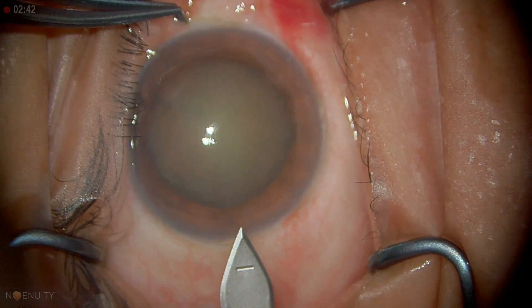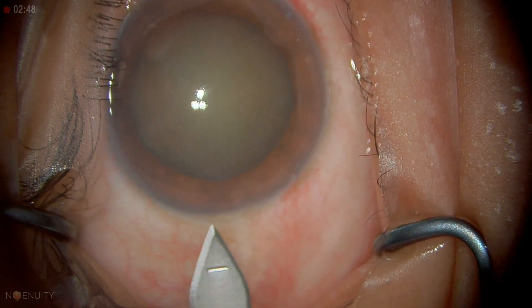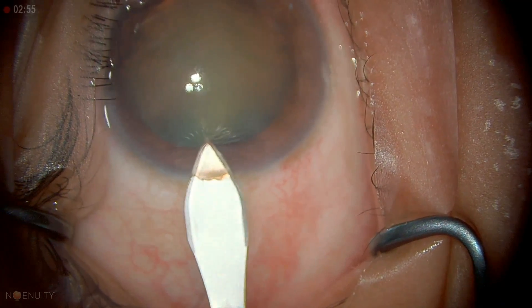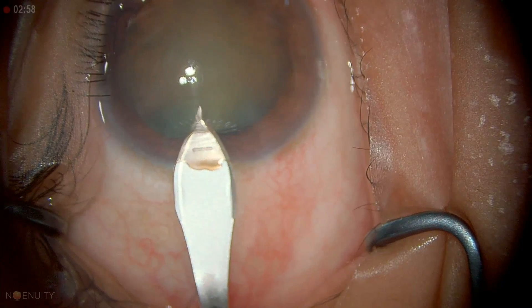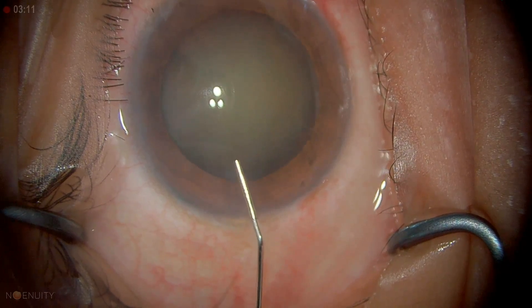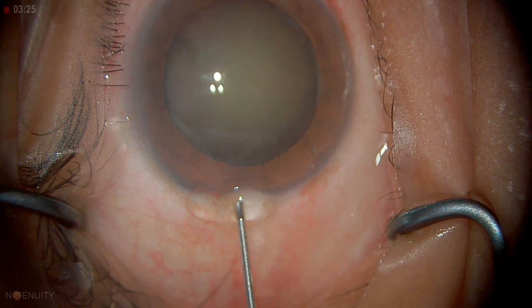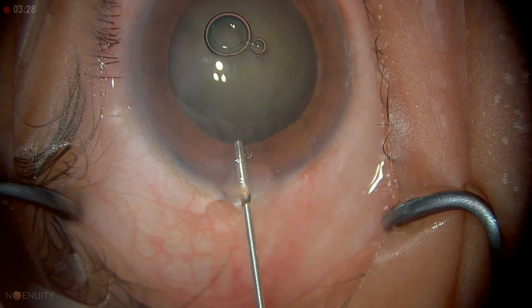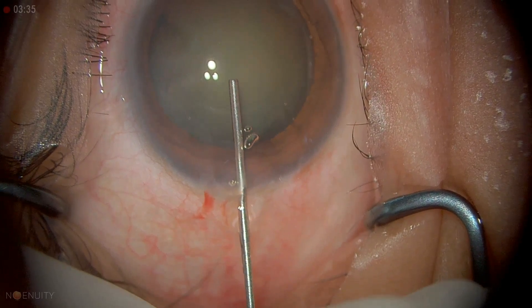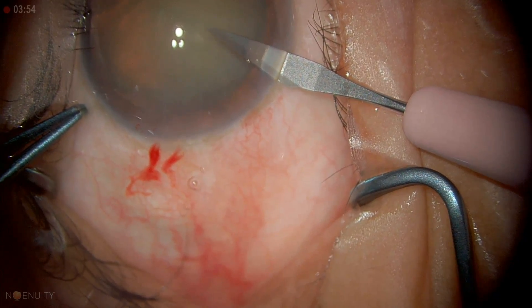This is a reasonably dense cataract, both cortical and posterior subcapsular. I'm using a 2.75 blade. I make a temporal incision because in my hands that is the best for controlling surgically-induced astigmatism. I'm going to give a touch of intracameral lidocaine — the eye is blocked very well. This is Viscoat, which I'm injecting at the wound edge, filling the entire anterior chamber. Now I'm going to make two sideport incisions.